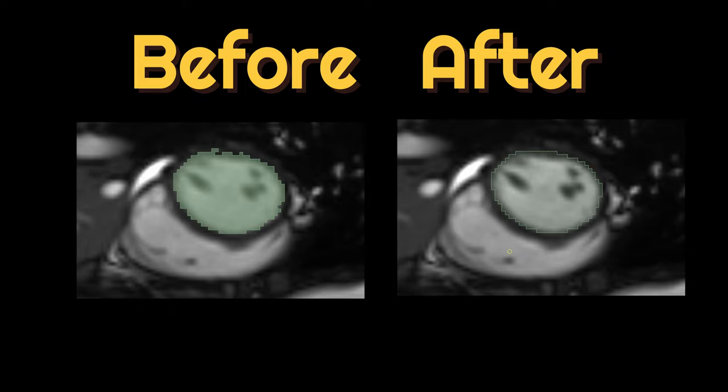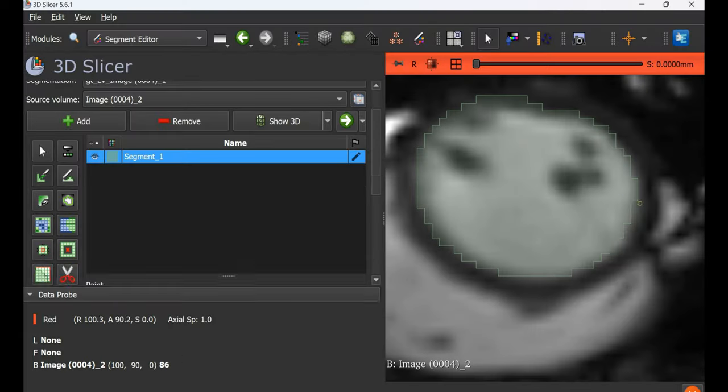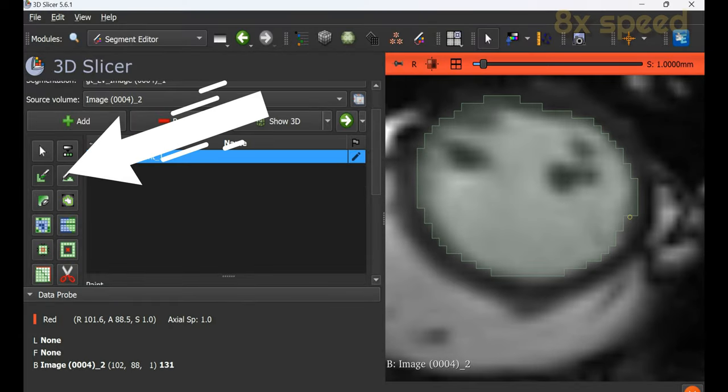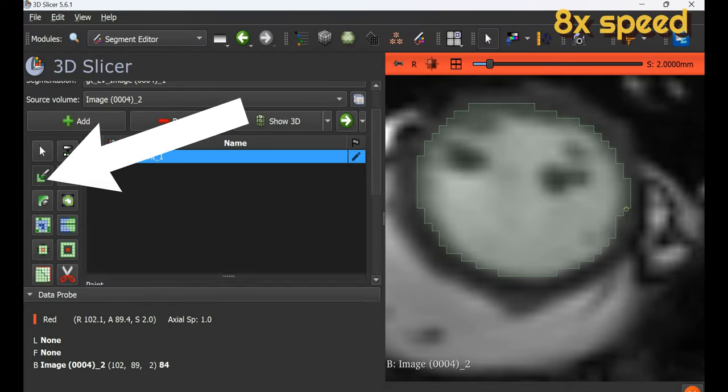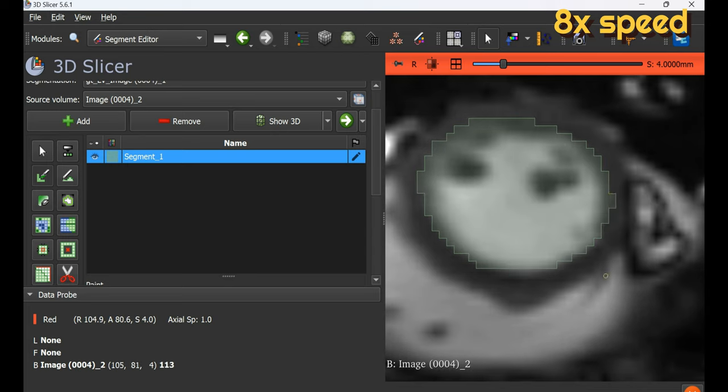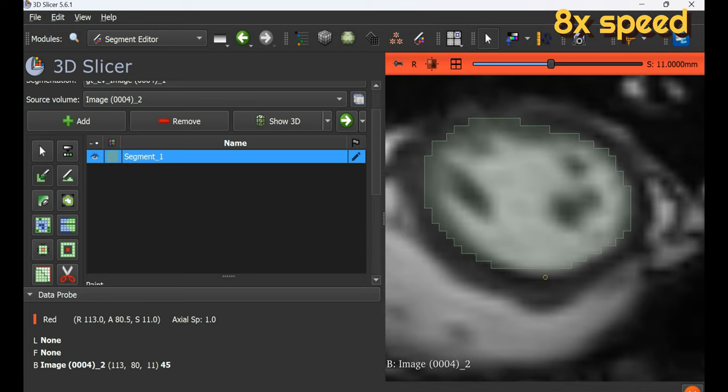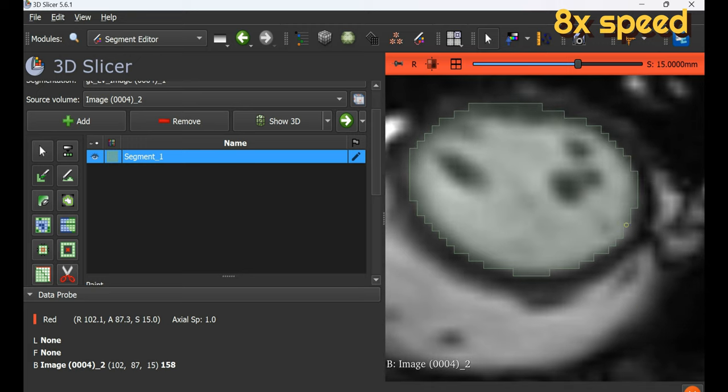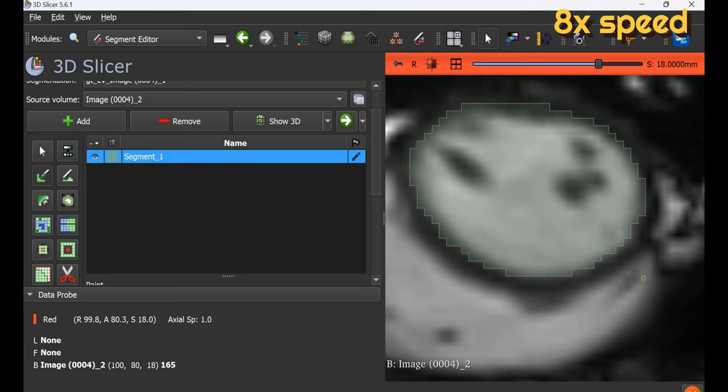Next, if you want to increase the size of the mask, you can use the paint brush and paint over the region where you think the mask should be present. This tool works on a single slice at a time, so we go through all the slices and edit them.